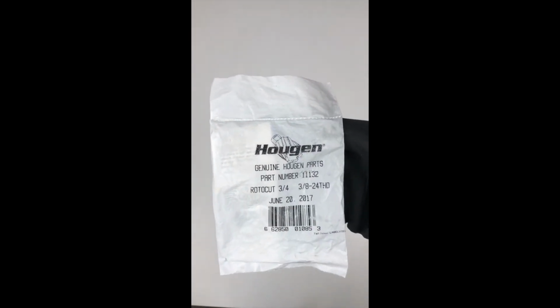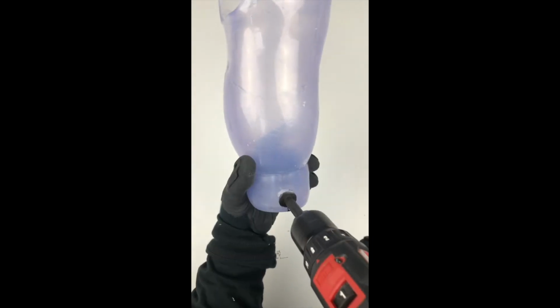Use a 3/4 inch roto bit from Bulldog Tools or a 3/4 inch step bit to drill out the side hole for the puck.